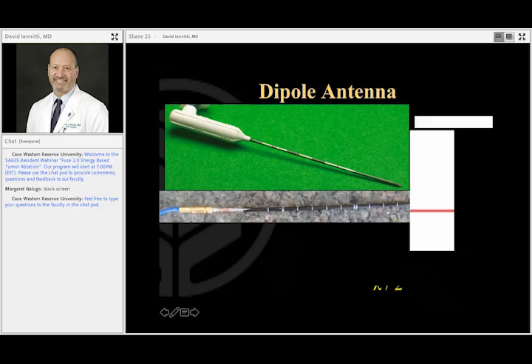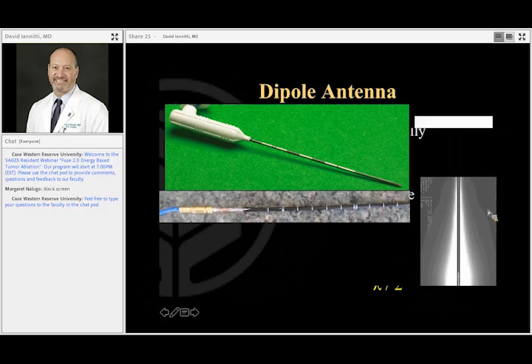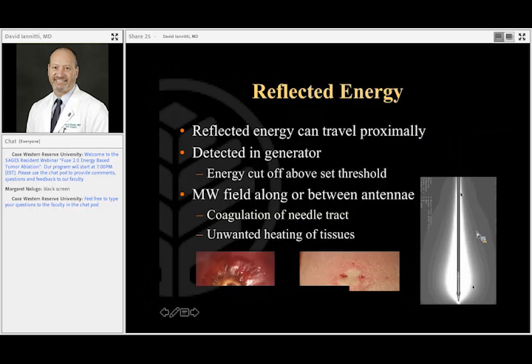The other downside of uncontrolled reflected energy clinically is that you can have waves traveling up or even between multiprobe microwave antennas, and you can conduct waves up more proximally, and that can result in burning of tissue. Like this is a skin burn that I created because my antennas are too close together, and that's sort of an unwanted outcome. So you have to understand all these things.